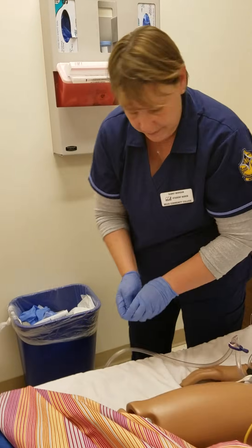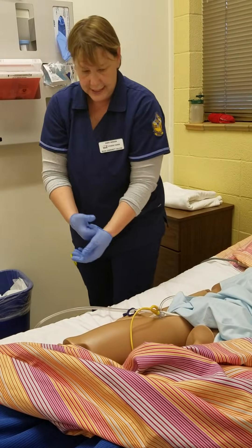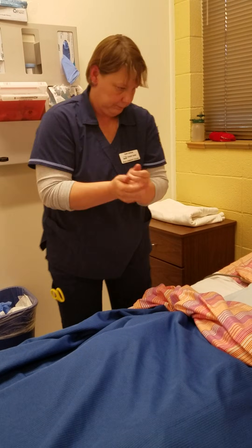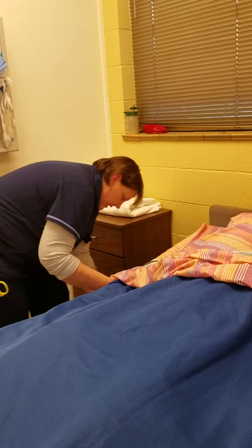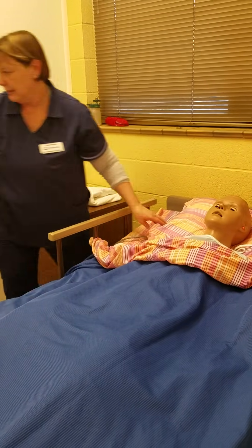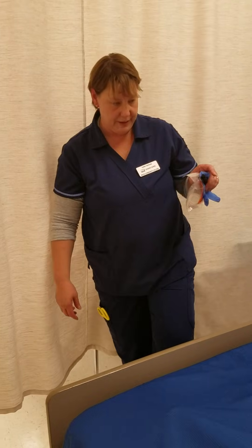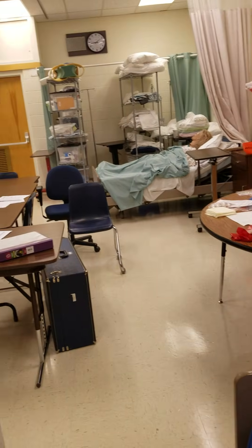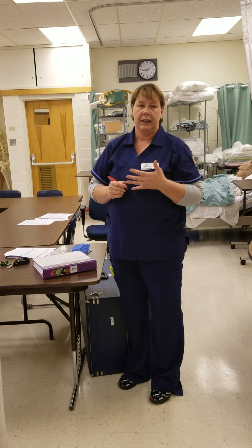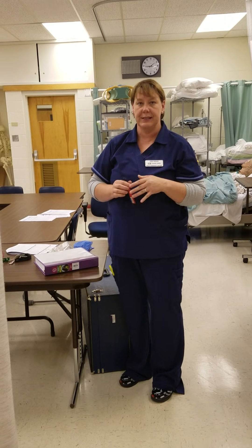When I'm through with that, I'm just going to clean up and unclamp the catheter. Jose, I'm completely done now. I'm going to take off my gloves and wash my hands. Is there anything else I can do for you? He says no and he's completely fine, so I'm going to sit him back up, lower the bed, and make sure the handrail is up and that his call bell is with him. When I'm finished, I'm going to document that I collected the specimen, the color and odor of the urine, and how much I took out — 20 to 30 cc's — and that it was sent to the lab.